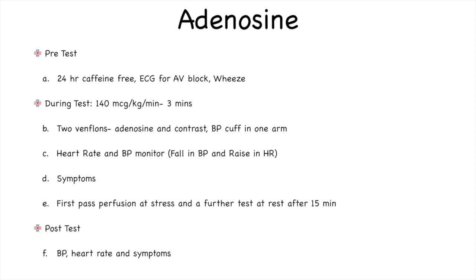Rest imaging is performed about 15 minutes after stress, where no adenosine is infused. Post-test, patient parameters of heart rate and blood pressure are monitored, and patient is discharged if he has no symptoms. Adenosine infusion is being found to be very safe in all clinical practices, and in our own experience, where we have done more than 1,500 cases in the last year and a half, it is extremely safe if we triage the patients appropriately.